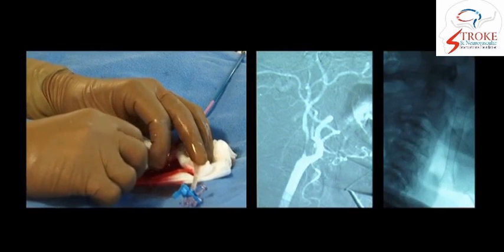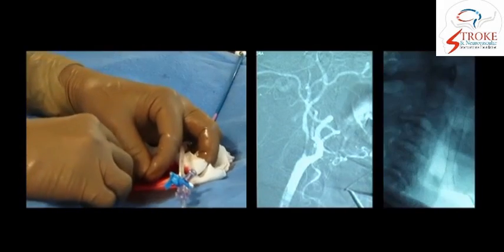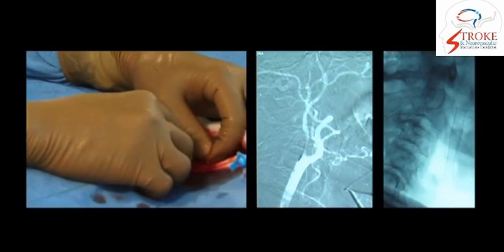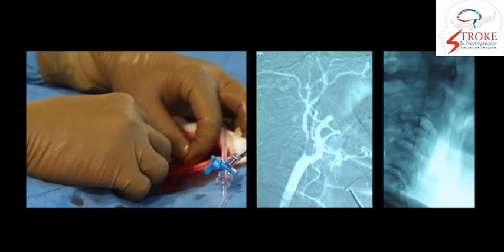Once the wire is distal, well placed, now the wire is being kept stable and slowly we are sliding the filter device, which is crossing the stenosis, and we will place it in the upper cervical ICA in a relatively straight segment of the artery.